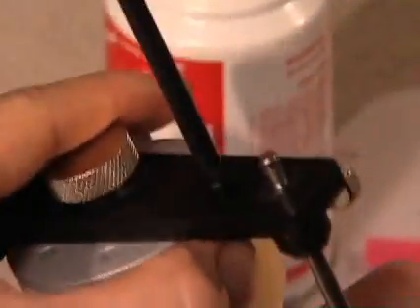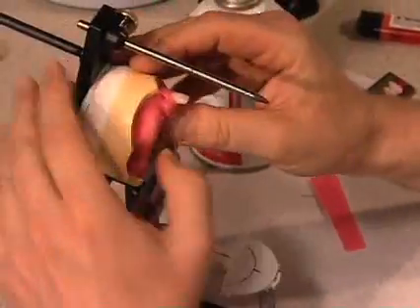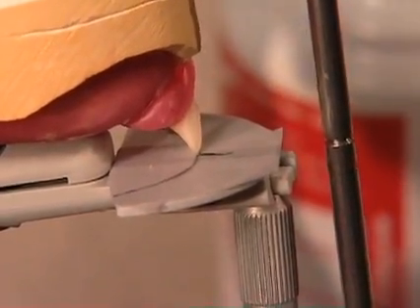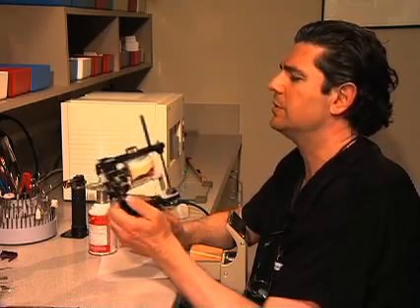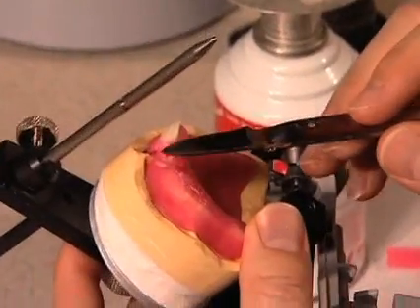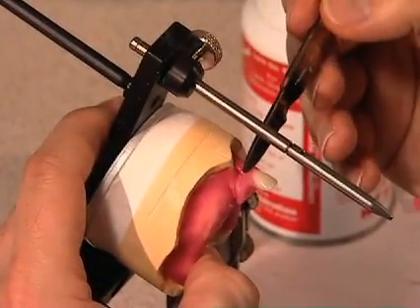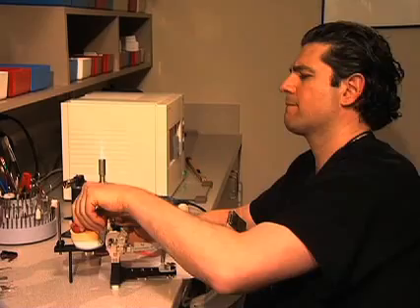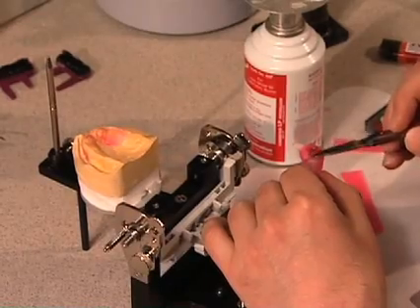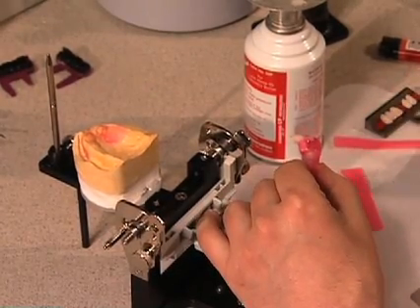It takes quite a bit of tweaking and positioning of your front teeth — the front teeth take the longest to set up. The inclination is pretty much perpendicular to the occlusal plane of the patient. Once the first tooth is set, seal it down before moving to the next. I'm now going to fill the flange with wax — filling all the voids — and part of the reason for doing that is it helps spatially in verifying the correct position of the front teeth.